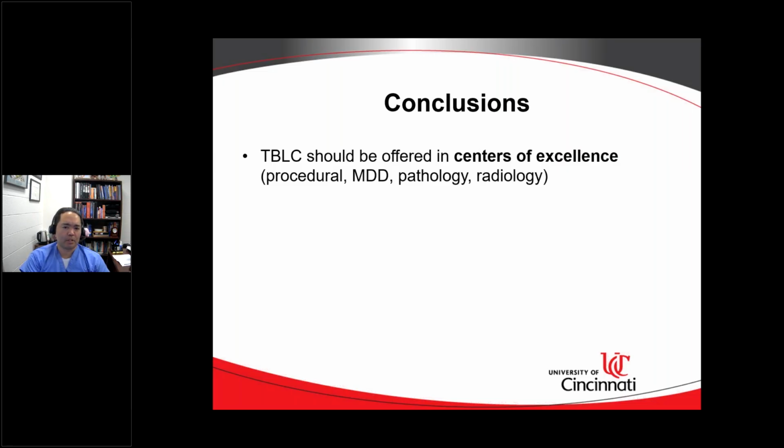Before 2018 or so, it was more like, how do we make this procedure as safe as possible? So the recommendations are, because there's going to be brisk bleeding with your cryobiopsies, have your scope there, have your Fogarty balloon, and talk with anesthesia and try to make this procedure as safe as possible. I personally believe that if you want to do cryobiopsy, you'll need to be trained on that. It's not as easy as it looks. But again, it's only one part.